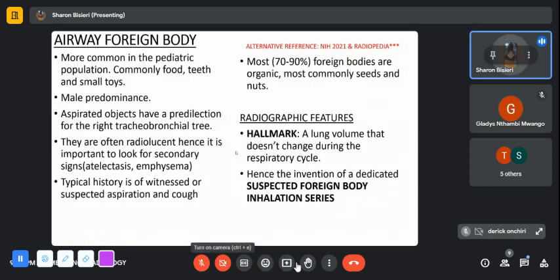So that's it for diaphragmatic injuries. Are there any questions before I proceed to the next? Yes? Yes, Daktari, thank you for highlighting that case. What would you advise the cardiothoracic residents who wanted you maybe to say something about the aorta? I hope you picked something.